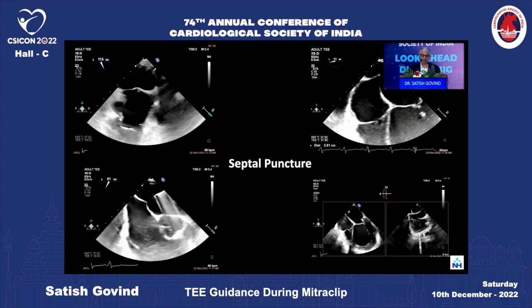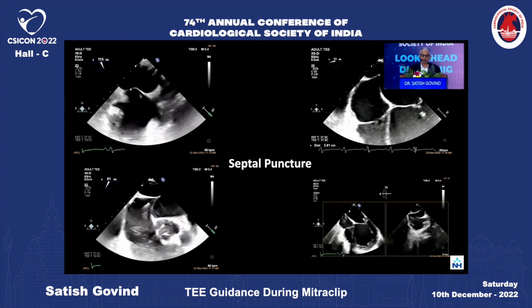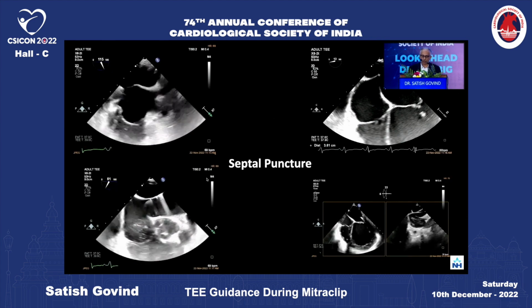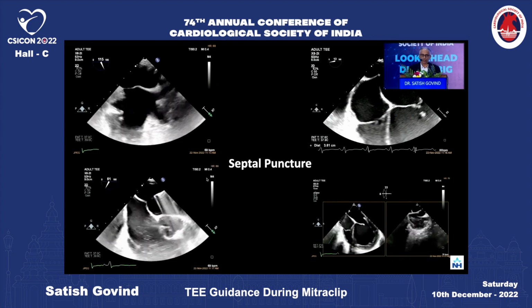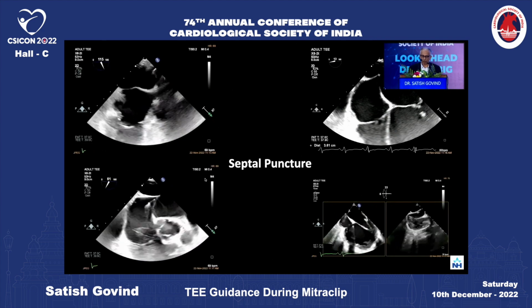At some point you decide to go for it where you have to be a little superior. You can't go too inferior. So that point is fixed. And then you go to the short axis also. You don't want to go too close to the aorta, because these are really big catheters. You don't want to get into trouble with the aorta. So you go a little posteriorly.